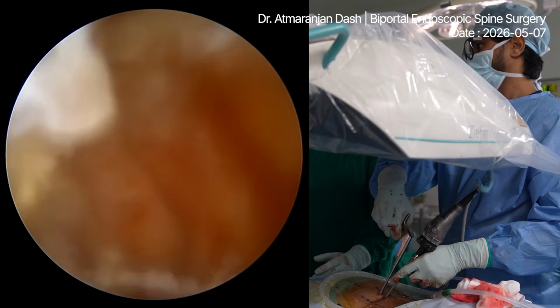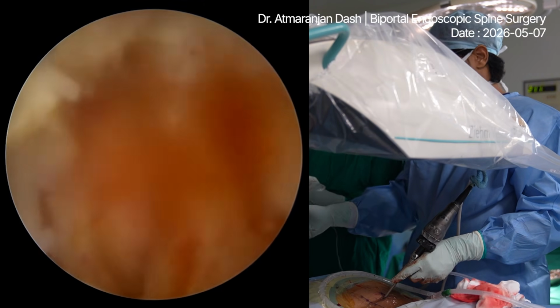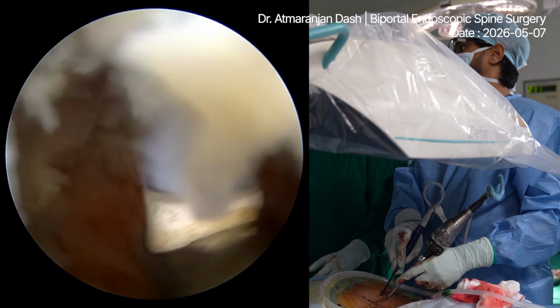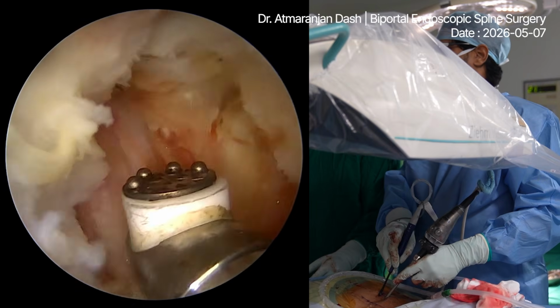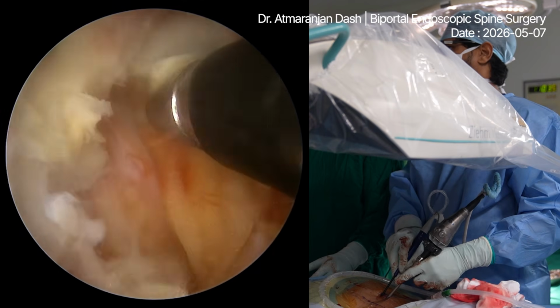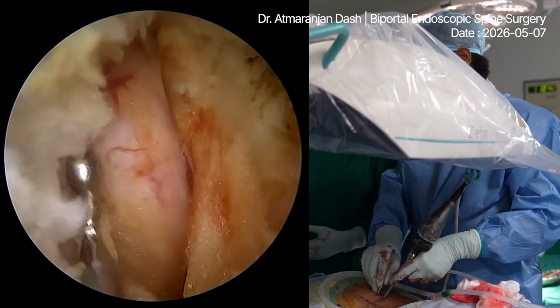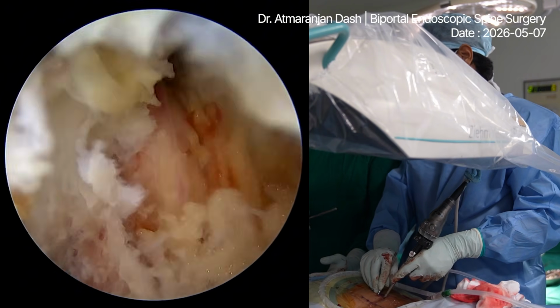Okay. Hook, please. Coagulation. So this is the superior articular process. This is the joint space between the two. This is the disc, and this is the root, and this is the foramen. So we are done. A wonderful decompression of the foramen. Everything looks better now. Bigger hook, please. You see how free the foramen is? Very free.